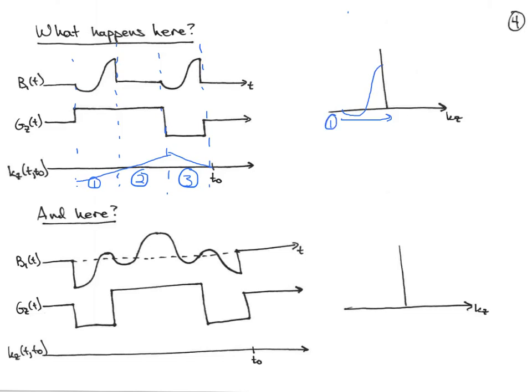Okay, time segment 2, nothing happens, right? But we do go further, we go more positive in KZ. So we'll just draw that out here. And in time segment 2, we go more positive. Okay, now what happens in time segment 3? Now we start out positive, and we go back to 0, right? So we start out where we left off with 2, and we go back to 0.